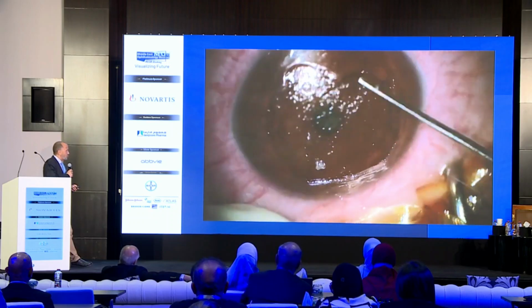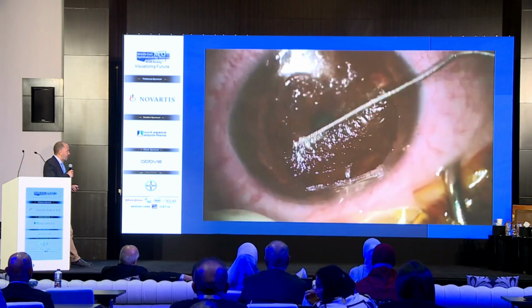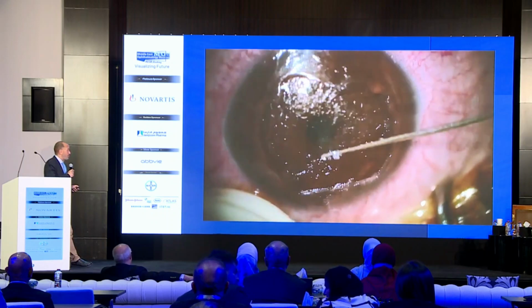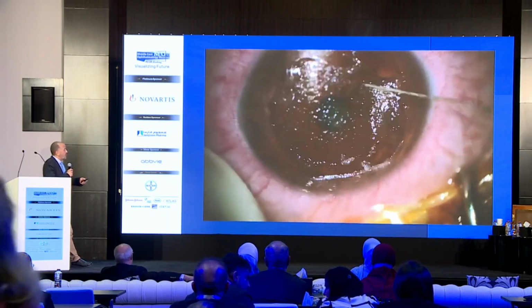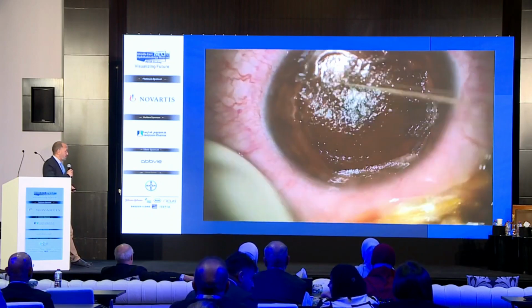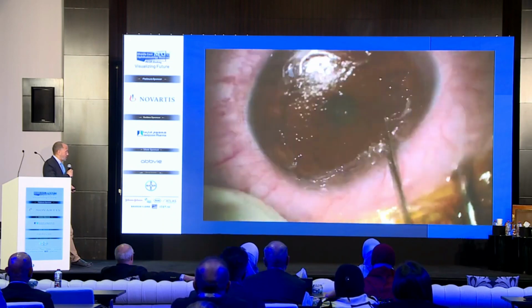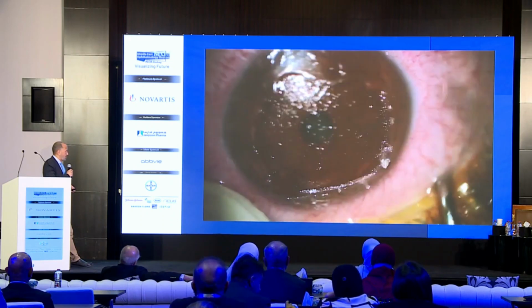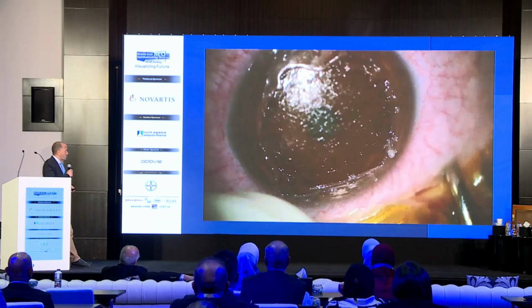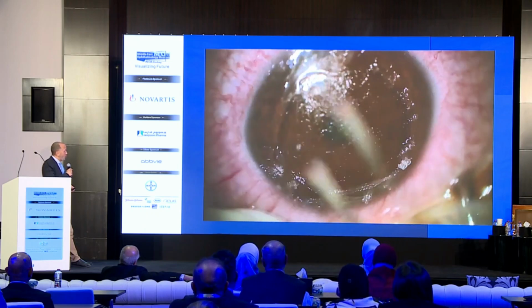I really had to clean a lot because there were a lot of hidden epithelial nests on the apparent bare stroma. You see, the more you scrape the cornea, the more epithelium comes out. It was a real mess. It's just a very short video. And the lower part of the stroma was molten. This was a full thickness epithelium that had to be removed as well.